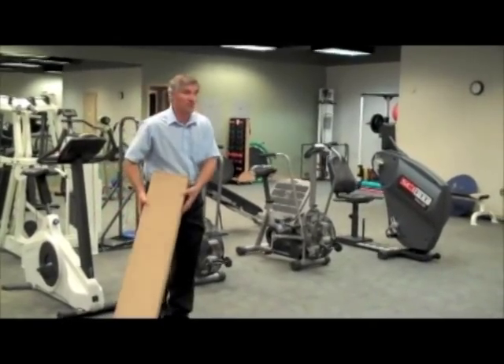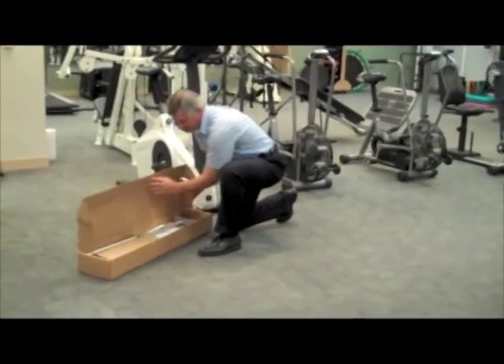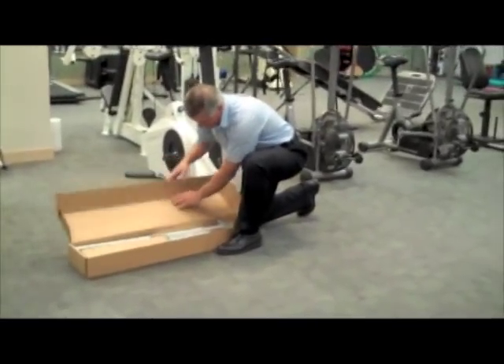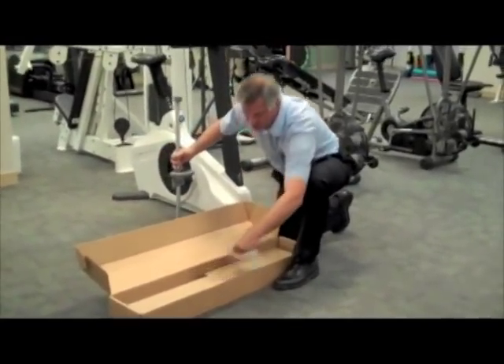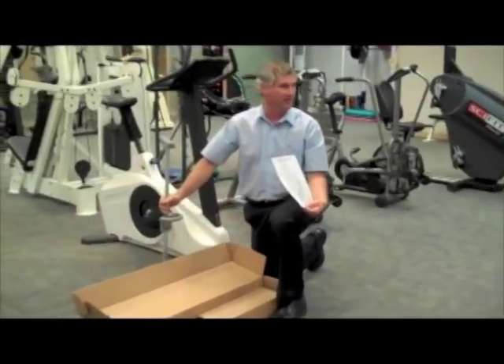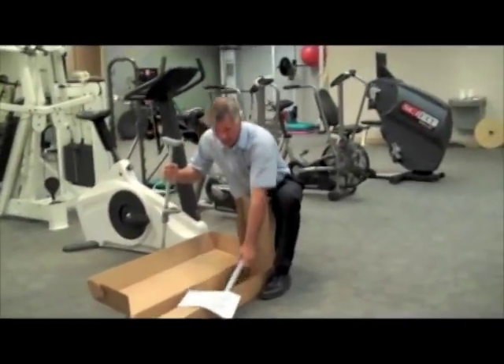With that, I'm just going to show you — it's very easy to assemble right out of the box. In the box we have just an assembly illustration; it really takes no explanation. It just has that, and I can pass some of those around.